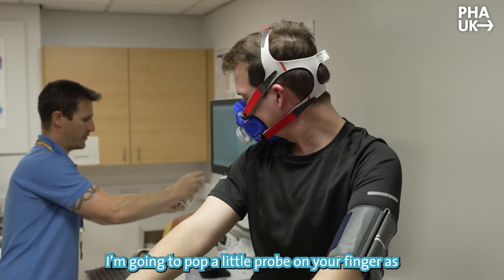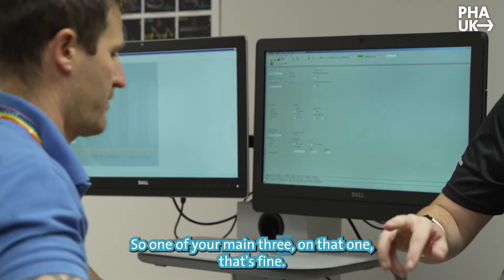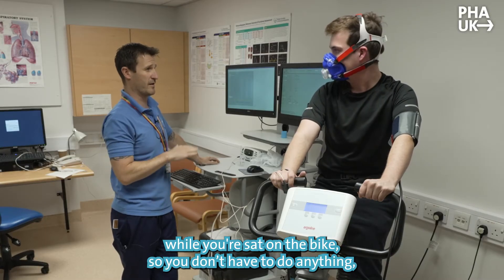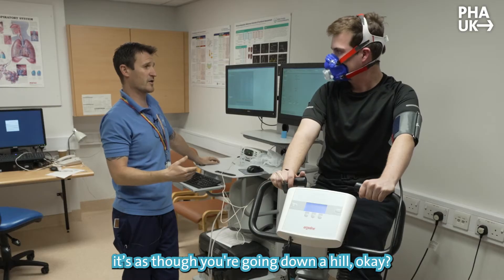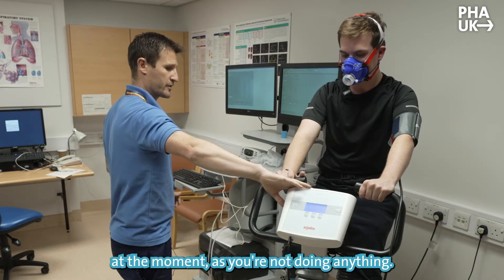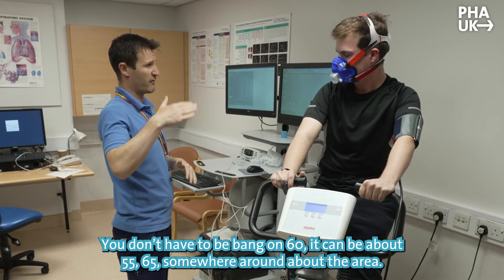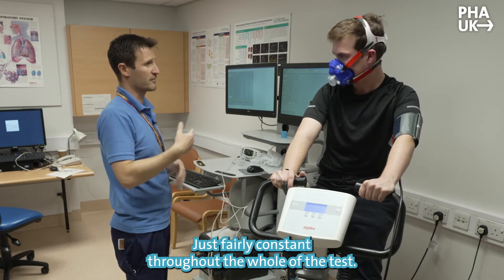We're going to pop a little probe on your finger to look at your oxygen levels and heart rate. For the start of the test we're going to take two or three minutes of resting measurements while you're sat on the bike. Then we'll get you pedalling against no resistance — it'll be very easy to begin with, like going down a hill. Your job is to keep it at a constant pace of around 60 RPM. It can be 55 to 65, but don't go up to 80 or drop to 40 — keep it fairly constant throughout. It'll just get harder and harder as you go up a steeper and steeper hill.